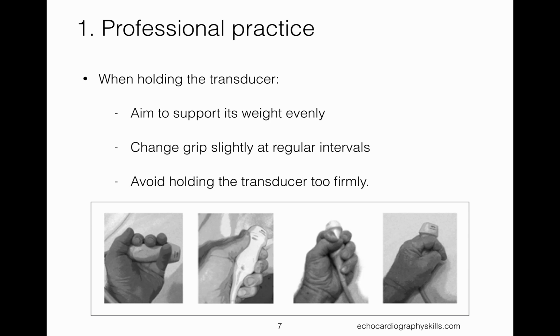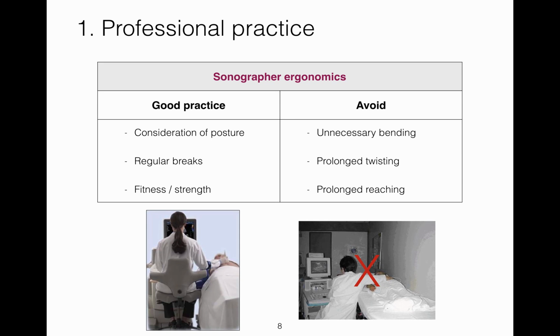When holding the transducer or the imaging probe, aim to support its weight evenly. Change grip slightly at regular intervals and avoid trying to hold the transducer too firmly. Good imaging practice includes constantly considering your posture while imaging and taking regular breaks, as well as maintaining good general fitness and strength.